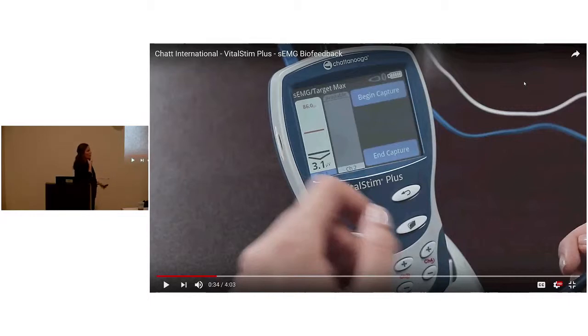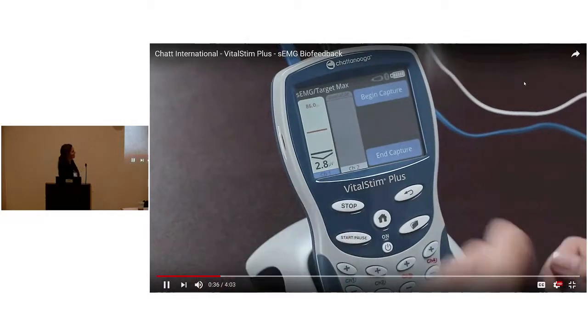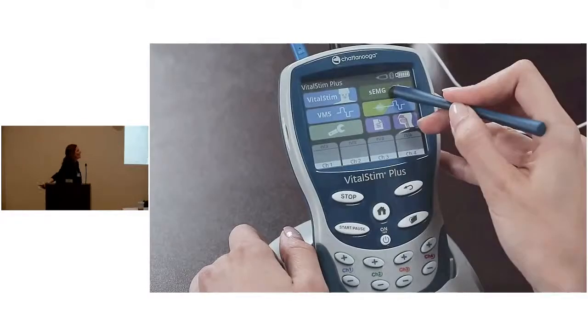But so that's measuring. If you're doing like a hard swallow, that's like the best placement to measure the movement of the swallow, and then you see it. So another thing to note is when you use this part, you have to unplug everything in the room and put your cell phone in a different room. A lot can go wrong. Hold on, unplug everything. Unplug yourself.